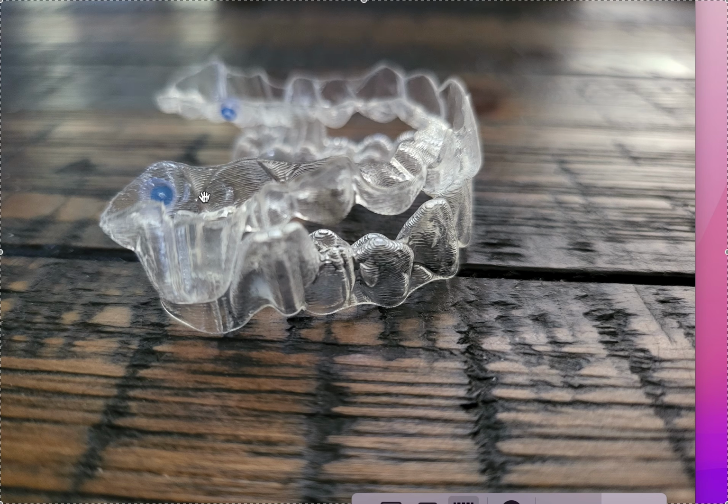Usually MA is somewhere between 30 and 40 aligners. That's first run, okay? And then once you're done with that part of it, you either do a refinement and do a little bit more, or you just do a refinement just to settle the bite and fine tune it, and you're done. You've already grown the jaw. So all in all, how long will it take? About a year to 2 years. But it's no different than braces. That's going to take a year to 2 years too, right?